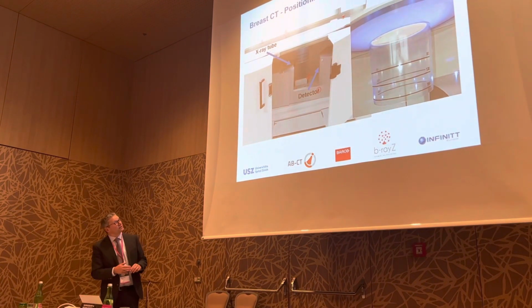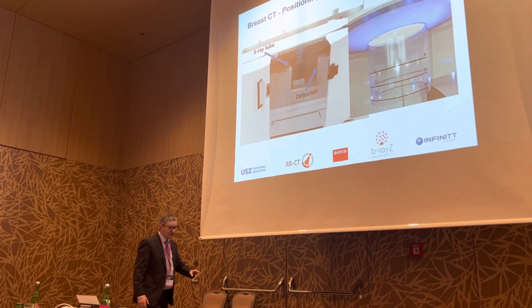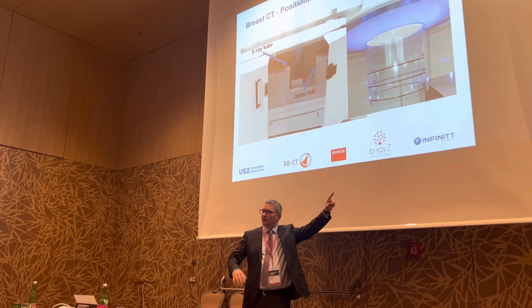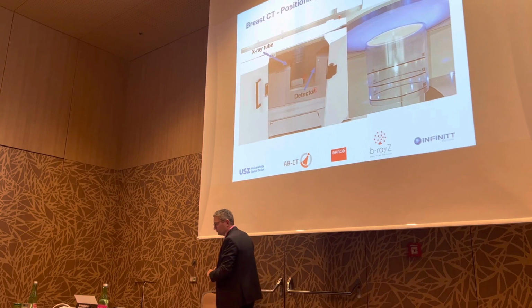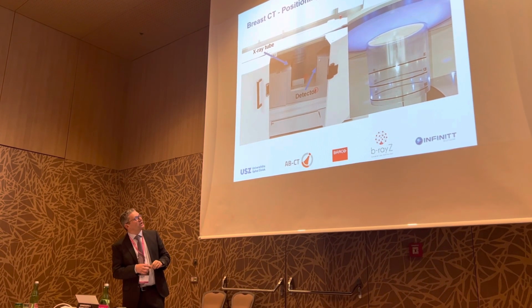So this is how the system looks from inside. The technician looks from the side at the length of the breast. This is important so that you don't scan, let's say, a range where there is only air inside. So you look at the length of the breast. This is one of the parameters which you have to fill in later on in the examination card.